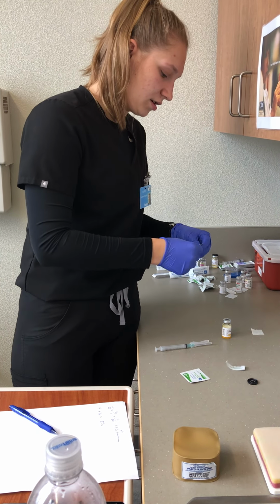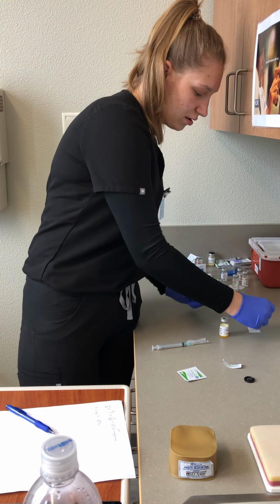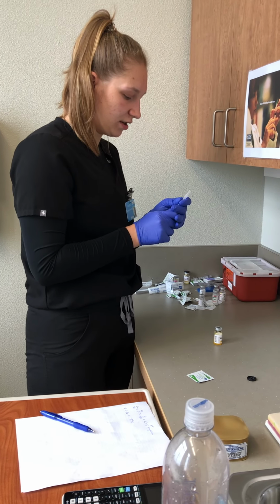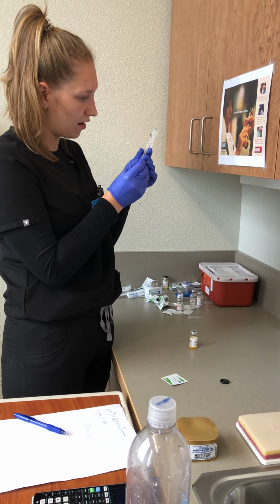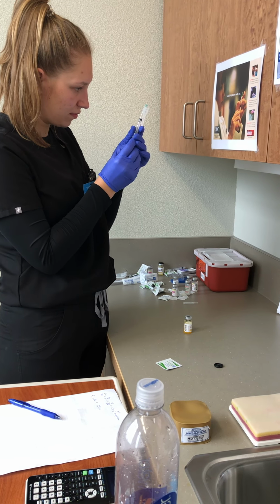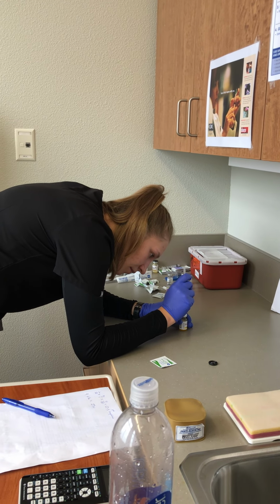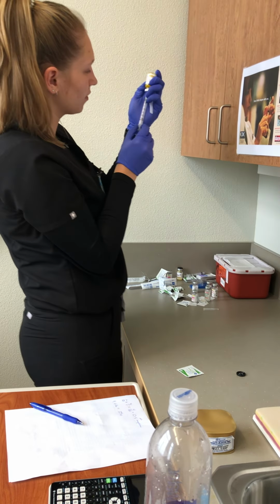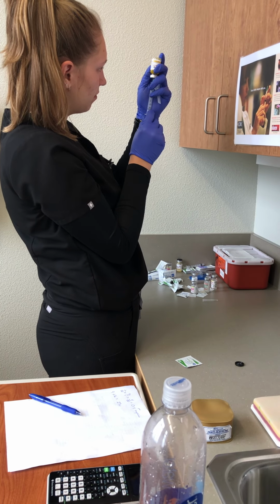I'm going to clean the top off again since I touched it. And I'm going to take my needle now. I'm going to pull back 1 milliliter of air. I'm going to inject this in. Invert it. I'm going to pull back 1 milliliter.